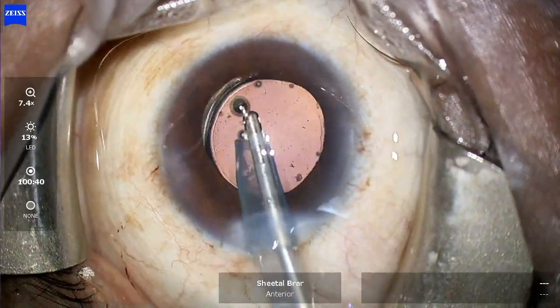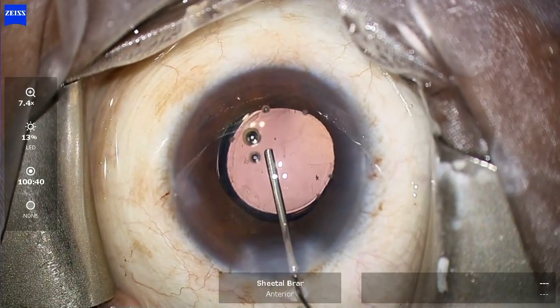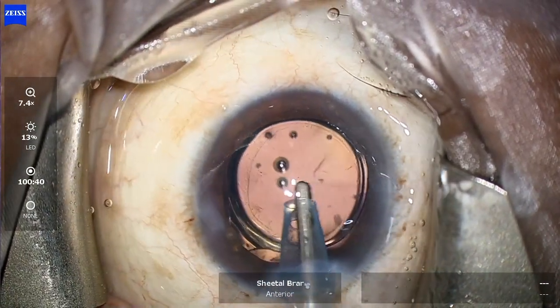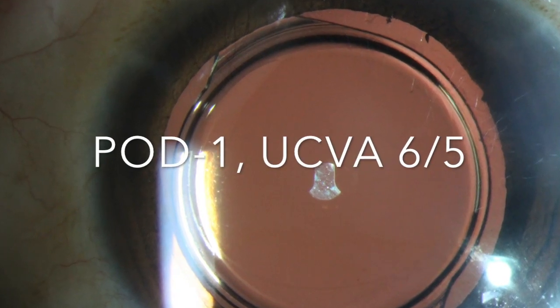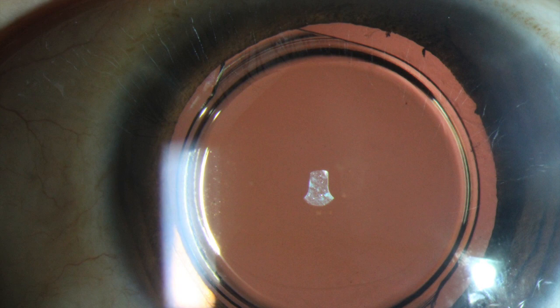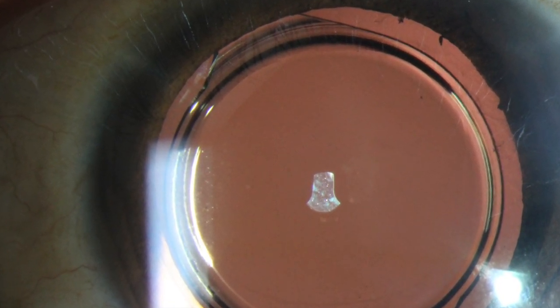The lens is now quite well centered. I go under the lens to wash out the viscoelastic, and the remaining OVD in front of the lens is also aspirated. With this, the case ends. On the first day post-operative checkup, the patient had an uncorrected vision of 6/5, and clinical photography showed the lens to be very well centered and stable in the bag.